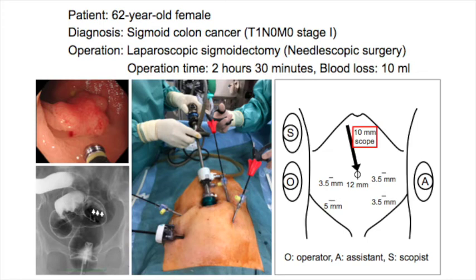The patient is a 62-year-old female with stage 1 sigmoid colon cancer. We show here a video of laparoscopic sigmoidectomy by needle scopic surgery.